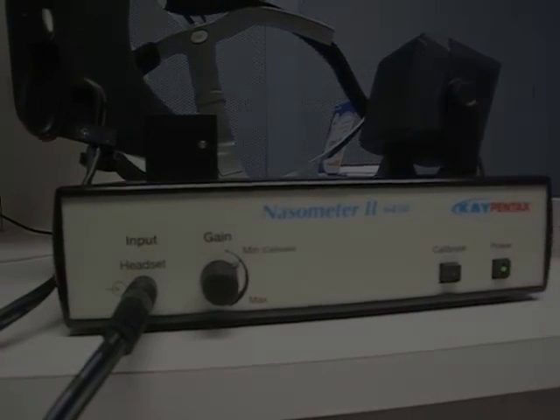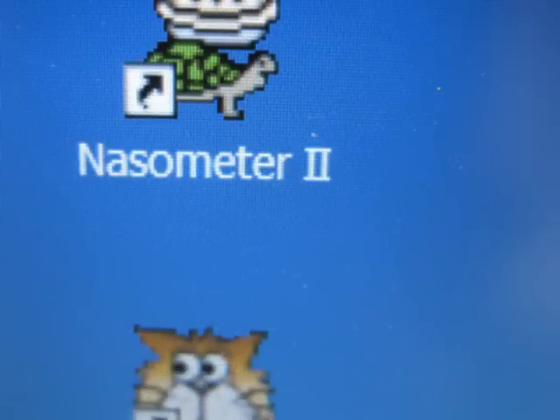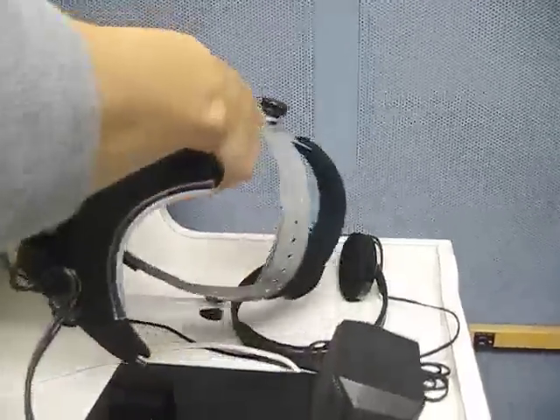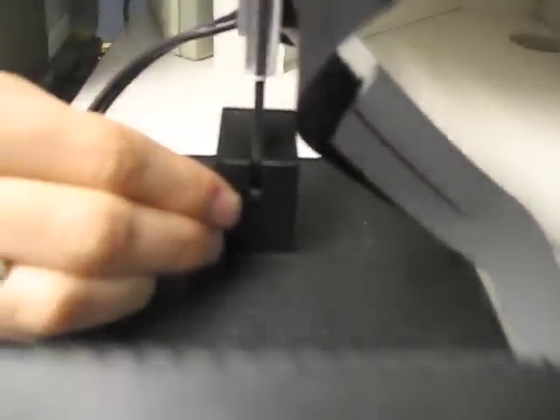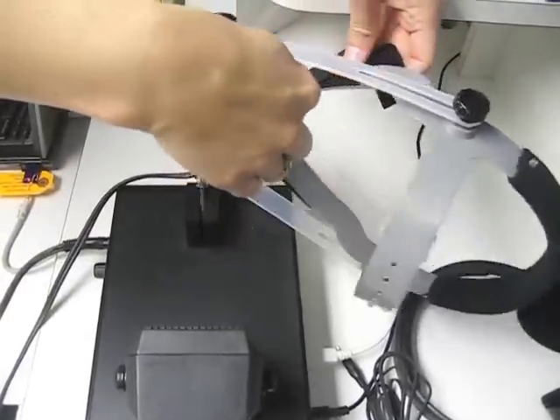After turning on the computer, go to the Nasometer 2 icon on the laptop and double-click. Then place the headset — it has a little latch — onto the nasometer machine. The nasometer has a bar down below where you'll be able to insert it and push it straight back. The speakers should be directly in line with the receiver.